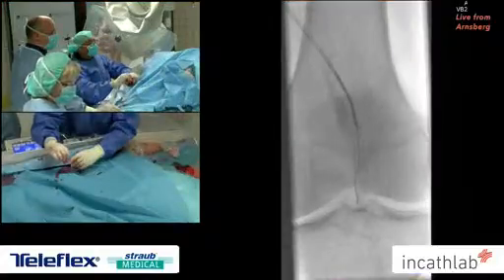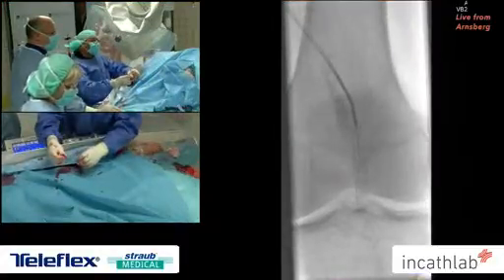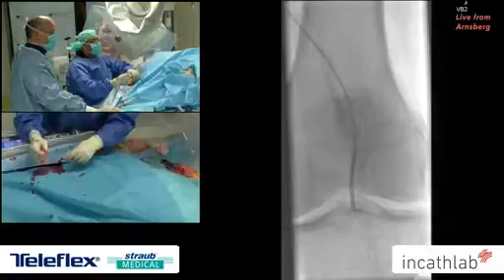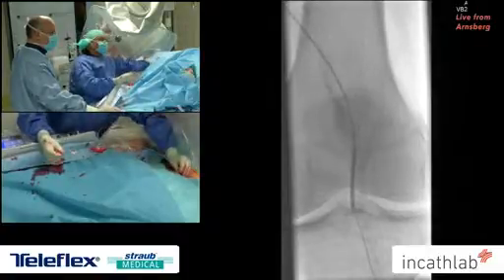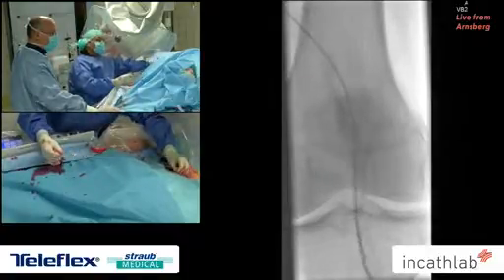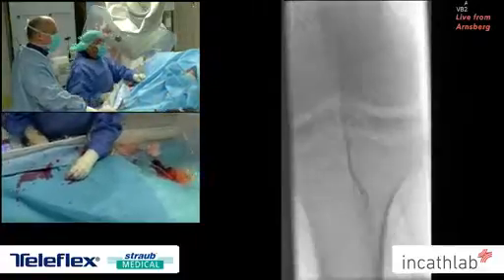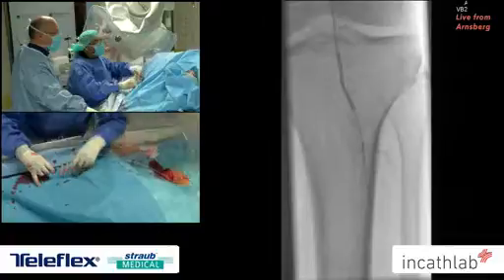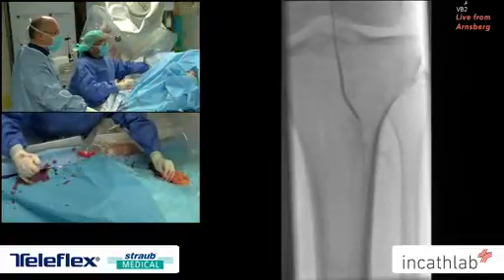You mentioned that it's very clear where you are when you're using this catheter in recanalizing such occlusions. So would you have the feeling that this might be better than coming from retrograde, so that you might spare retrograde procedures in the future if you use such a catheter?